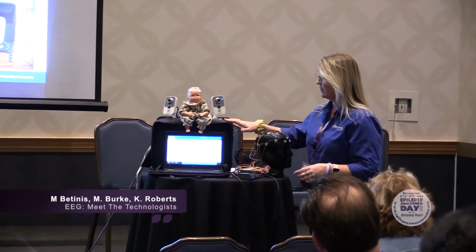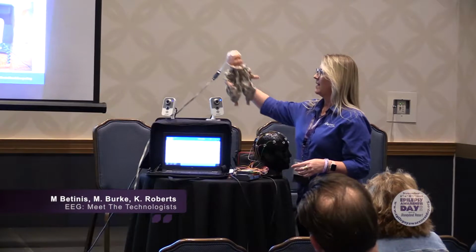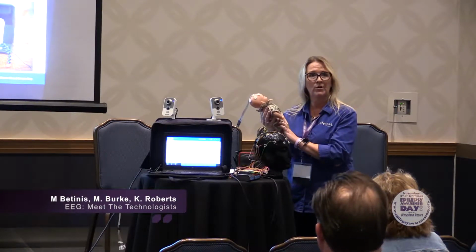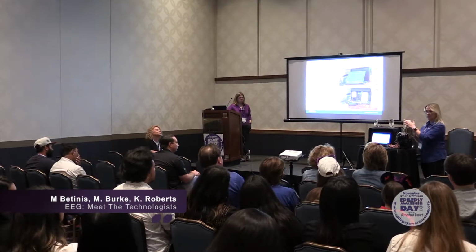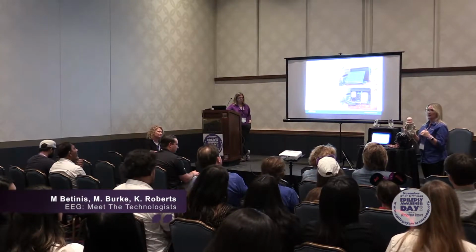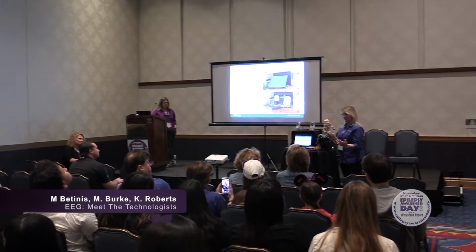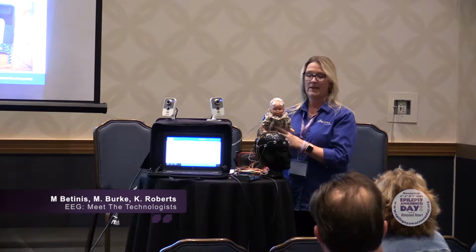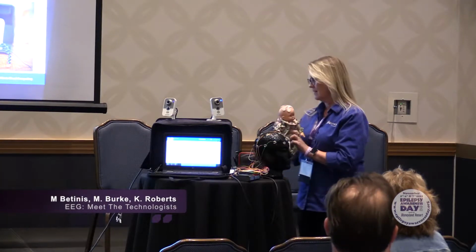This is our system, ambulatory EEG. This is my cute little baby that I like to bring everywhere with me. This is our neonatal monitoring electrode array. Babies that are born sometimes have a lot of issues at birth. So this is a new electrode array that we've developed that's a non-invasive electrode. Sometimes they have to use needle electrodes in the neonate and or NICU, and so we're trying to get away from that. So we've developed this nice array that can just go directly on and the nurses can apply it. So I just wanted to show you this.